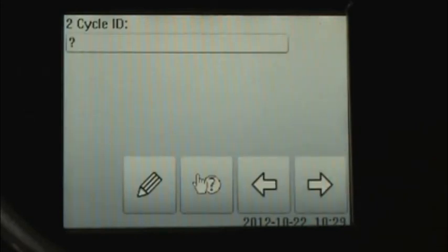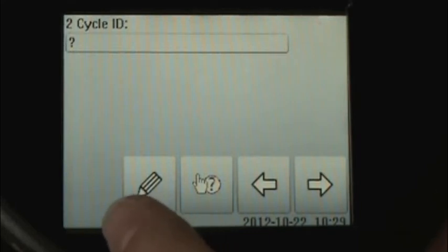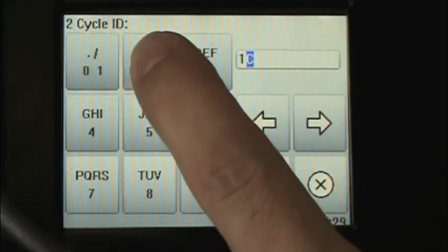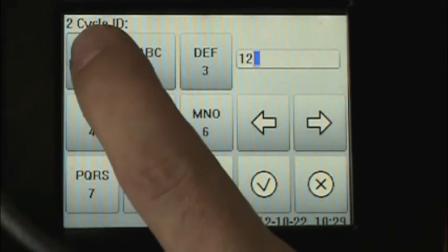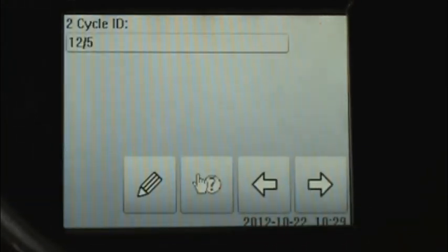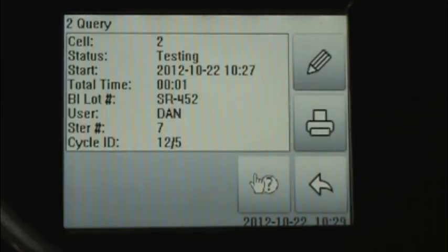The next item of interest is the cycle ID number. This allows you to tie the biological indicator to the specific sterilization cycle. We click the pencil to write the cycle ID number, then click the check mark button. We then advance to the next screen, and now we can see a review of the information we've just entered. This tells us cell number two, the BI status is testing, the incubation start time, the total time elapsed thus far, the BI lot number, the user's name, the sterilizer number, and the cycle ID.